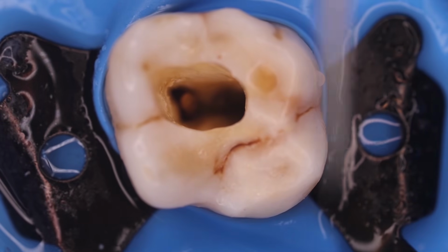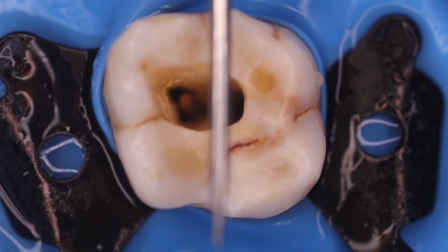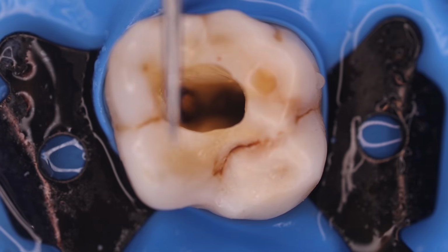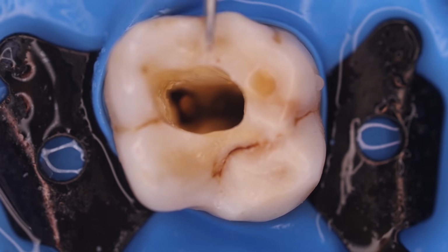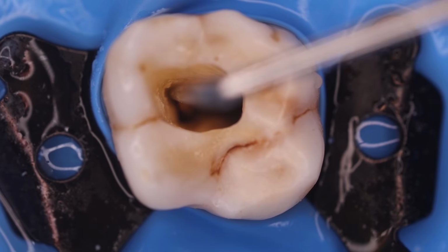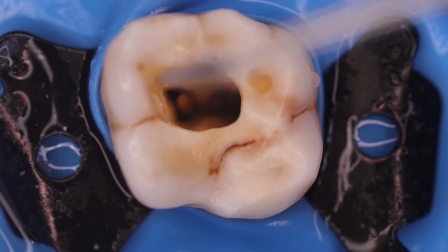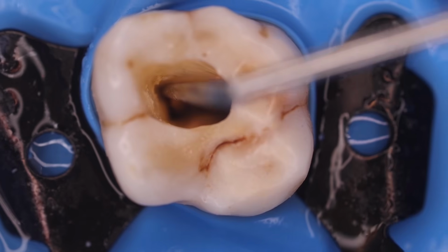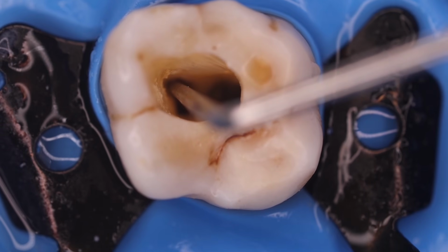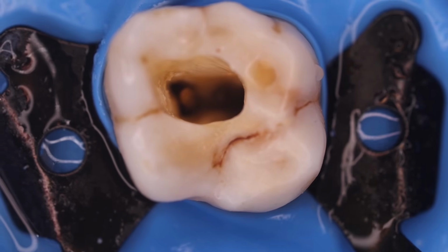Now we are using the DG16 probe to explore the canal orifices, as we have already widened the access cavity as per the outline form of the tooth. First exploring the mesiobuccal canal orifice. This is just beneath the mesiobuccal cusp, as you can see, and our DG16 probe is engaging into this orifice. So this is the mesiobuccal canal orifice.